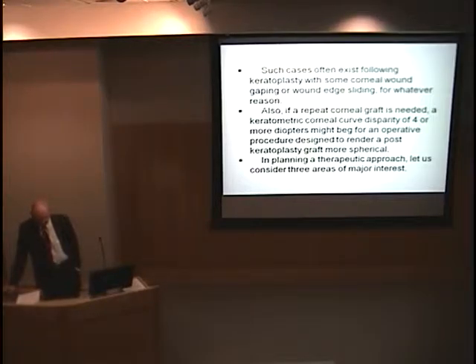Such cases often exist following keratoplasty with some corneal wound gaping. If these were the corneal edges coming together, with a little gaping, all it takes is a little gap and you can get a lot of diopters, a cylinder problem. Or wound edge sliding, and that occurs if the wound edges are like this and they slide. They don't tend to leak aqueous and get into problems there, but they sure give you a cylinder problem when the edges slide one on another for whatever reason.